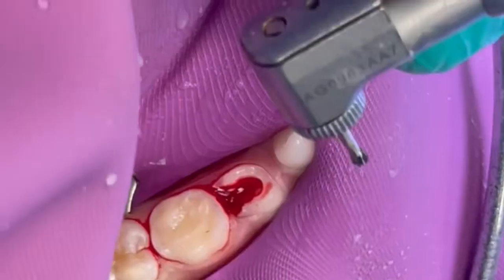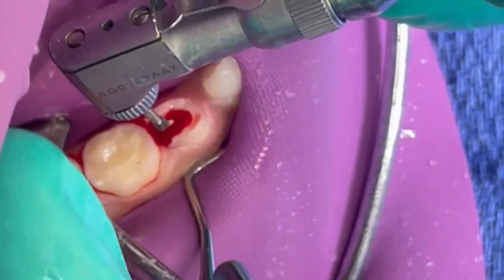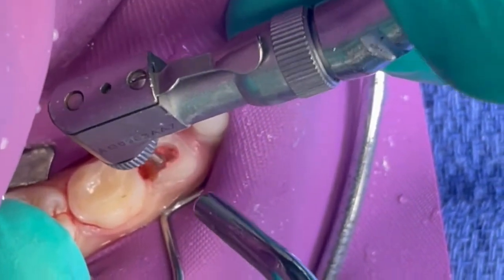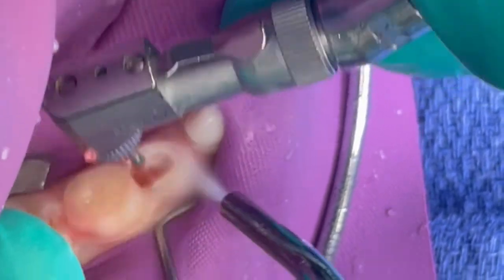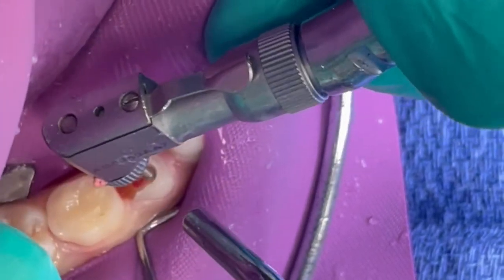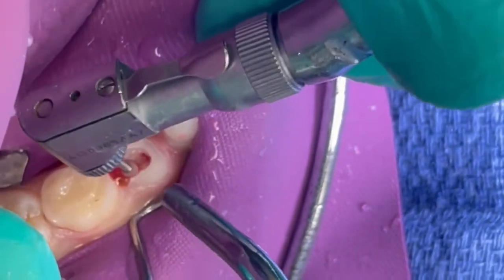In single-rooted teeth, like if you're doing a pulpotomy on D, E, F, G, or one of the canines, you want to remove the pulp to about the level of the CEJ, the cementoenamel junction, or slightly below. This is going to allow for enough MTA product — dicalcium tricalcium silicate product — to be utilized and have sufficient thickness, as well as having some type of obtundant that's going to cover that MTA product.